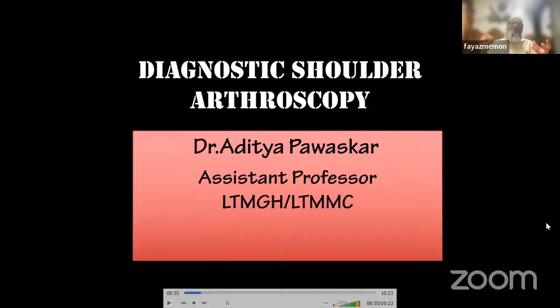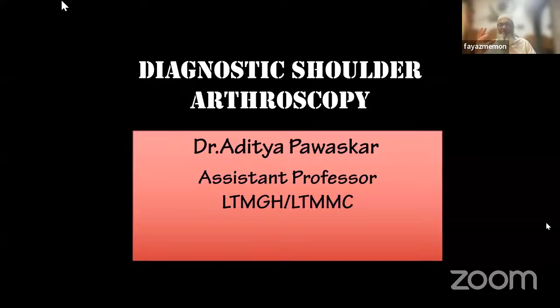Fayaz, do you always use the arthroscopic pump for shoulder, or what are your choices when you would not do it? And if you could just throw a little light on the pressures you use. Yes. So for a glenohumeral procedure, I don't use an arthroscopy pump. I just use the hand pump wherever required. So if I'm not able to see or there's some blood or something, I just ask my assistant to pump a couple of times, and it is just normal gravity that works.